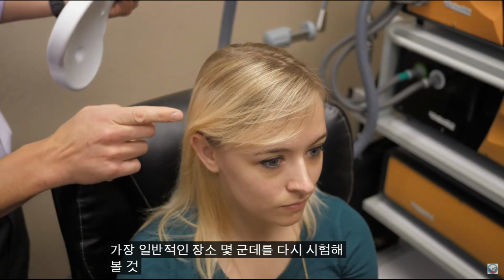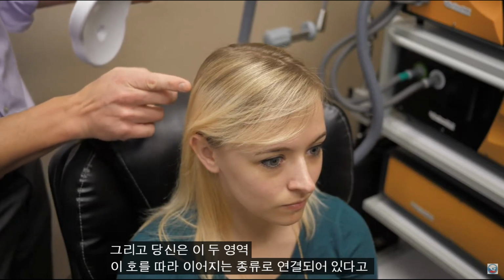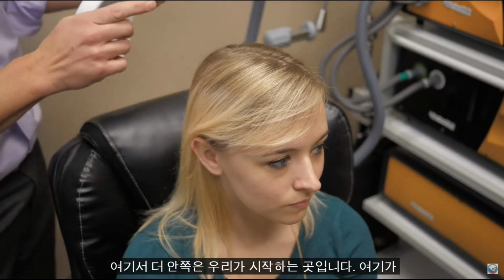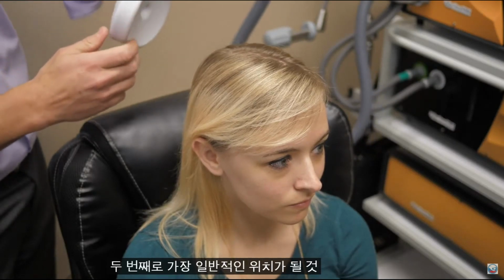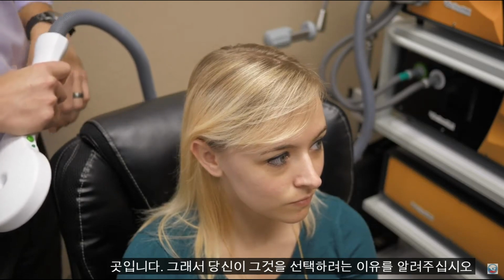The most common would be, again, if we're treating here and you think of these two regions connected, kind of follow that up in an arc. And here, more medial is where we would begin. This is where I would test to begin with. That would be the second most common location. Can you tell us why you would choose that to test to begin with?